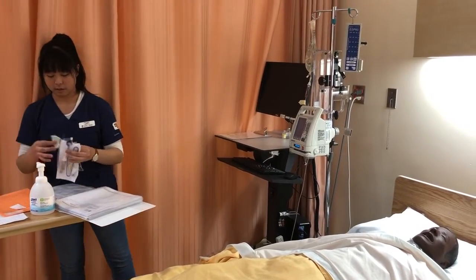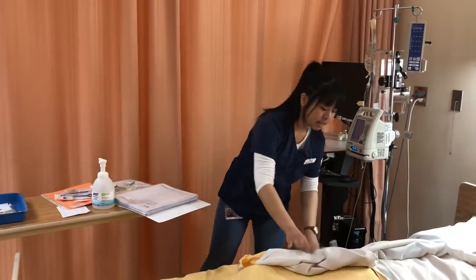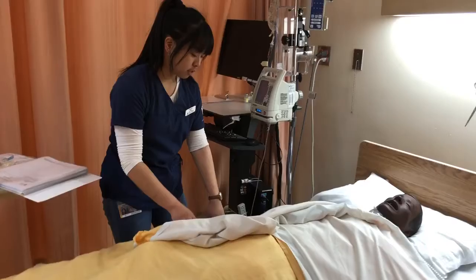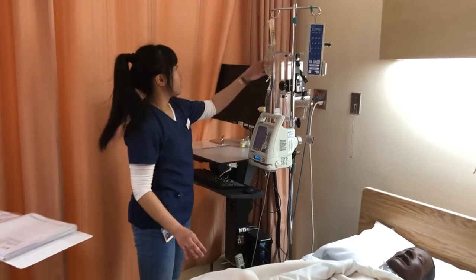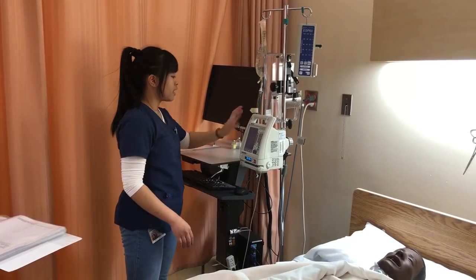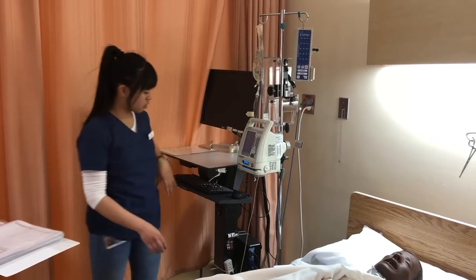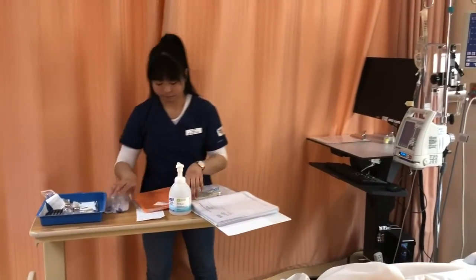Okay, so, and as I did that, I'm just gonna check the side. There is no swelling, there is no exudate, and the patient's not complaining of pain, so we're good with that. And it's the right solution running as well. The tubing is not expired, and it's within the right rate, so we're good with that, and there are no kinks as well. So I'm gonna do my third check.